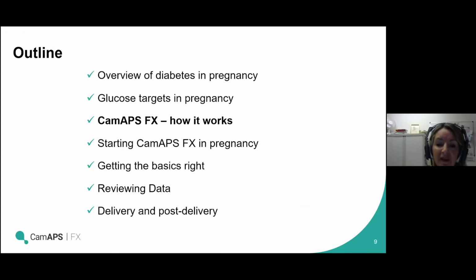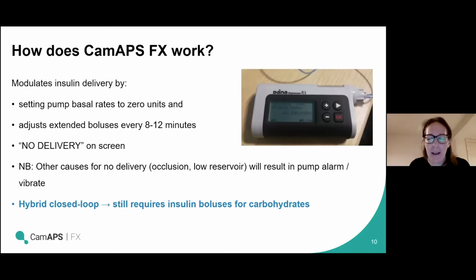So a little bit about the system and how it works, and then I'm handing over to Charlotte. Thanks, Helen. A lot of these things we've covered in our previous webinars. So if there's any bits that you feel you want to look at in more detail, then by all means go back to those, or also we've got some training modules as well. There's a few closed loop systems out and about, although this is the only system that's licensed for use in pregnancy. So just an overview about how this system works.